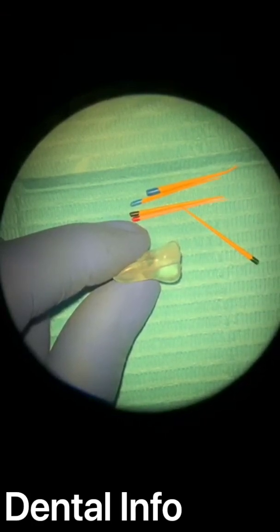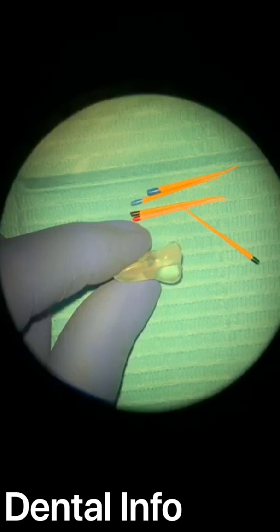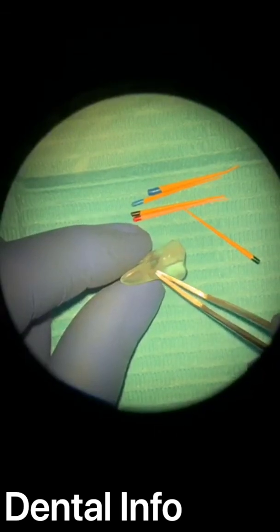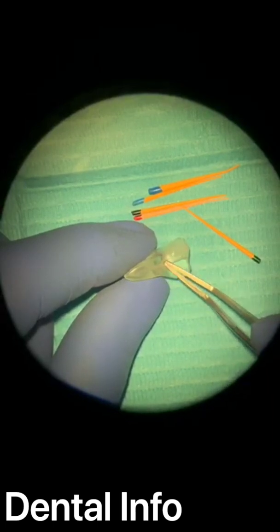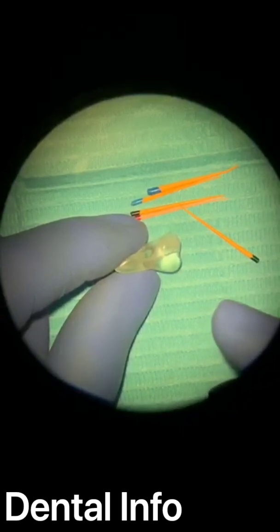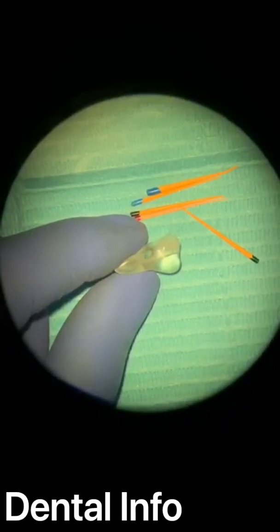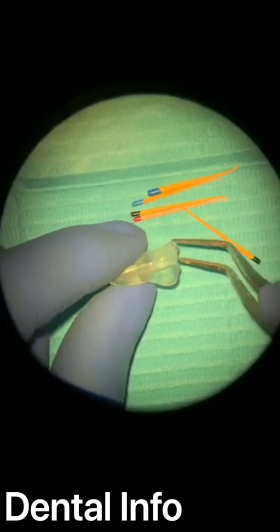For that, if you are using bioceramic sealer, I will not argue with you, because bioceramic sealer is not one for vertical compaction, right? But here we are using warm vertical compaction, so we have to lean on our gutta-percha more than sealer, because different people use different sealers. We are not talking now about bioceramic. We are talking about other sealers, resin-based sealers, zinc oxide eugenol sealers. So we have different sealers. So we have to lean here on our gutta-percha.